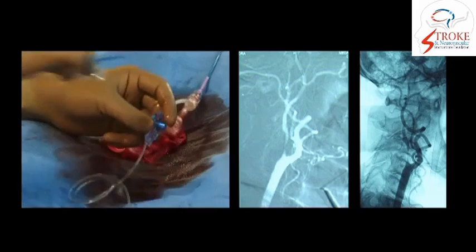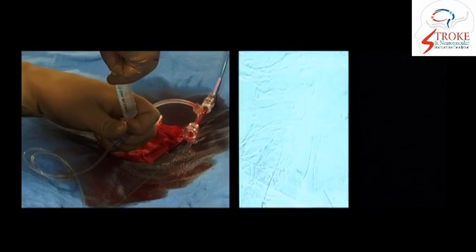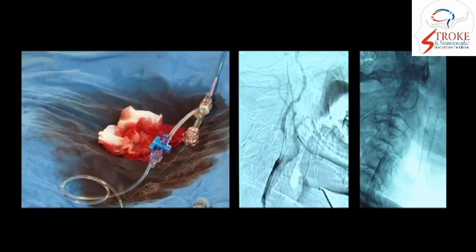Once the filter is released and we have taken out its catheter, we take a run to see the flow in the internal carotid artery. Sometimes in very severe stenosis, just placing the wire occludes the artery here, but we still can see good flow.